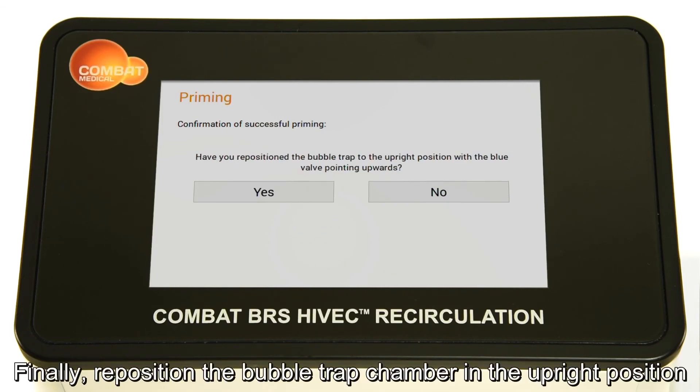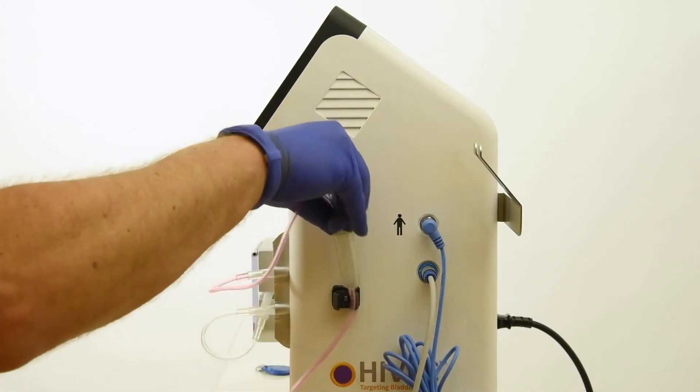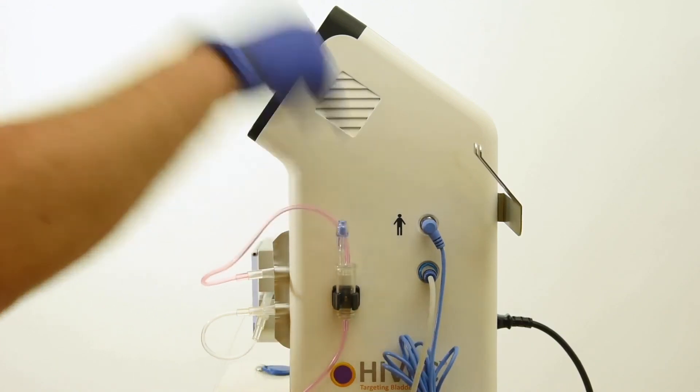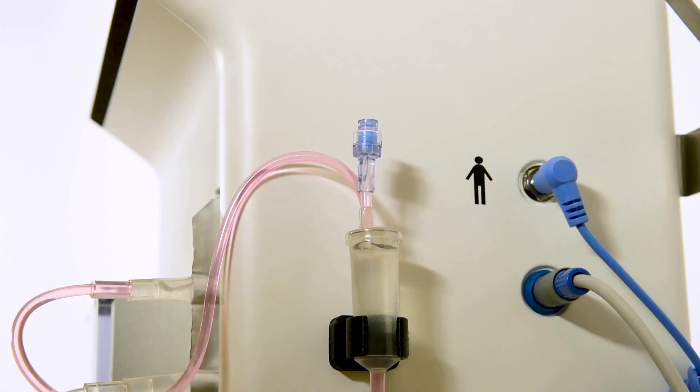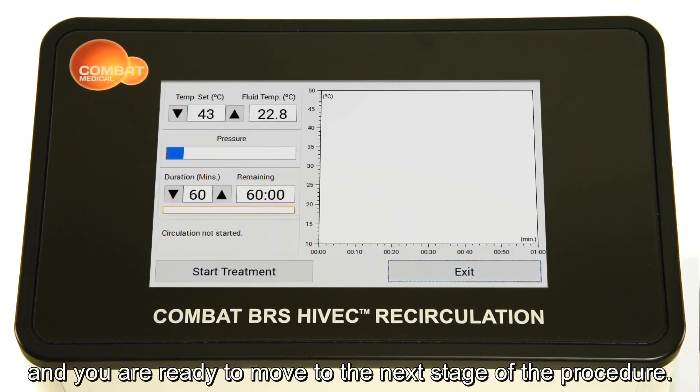Finally, reposition the bubble trap chamber in the upright position with the blue valve pointing upwards. At this stage you may remove the syringe and replace the white screw cap. Having confirmed, the treatment screen will appear and you are ready to move to the next stage of the procedure.